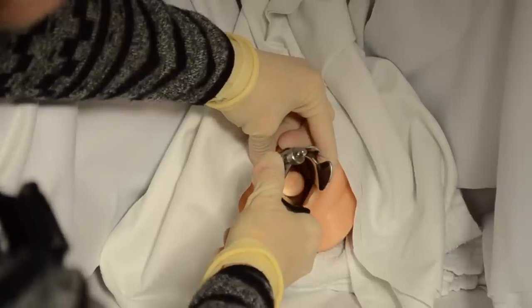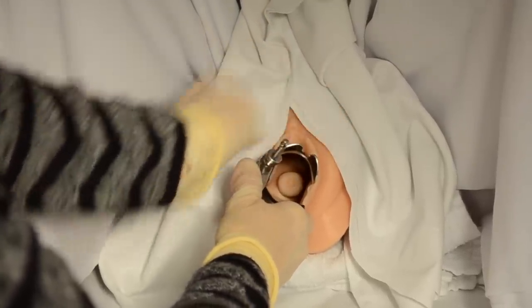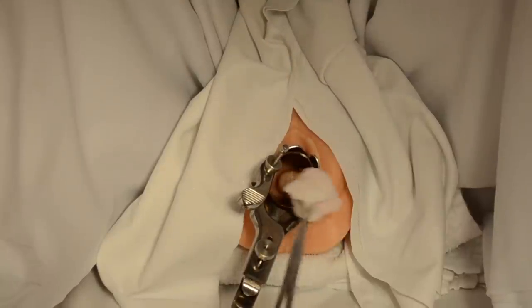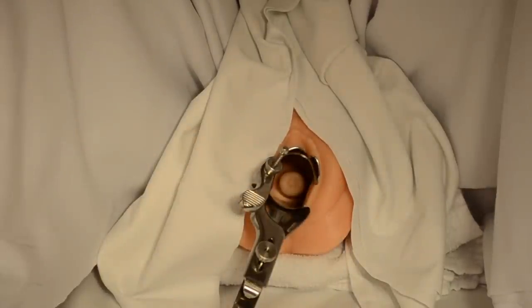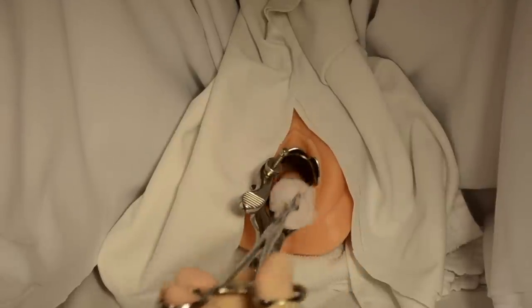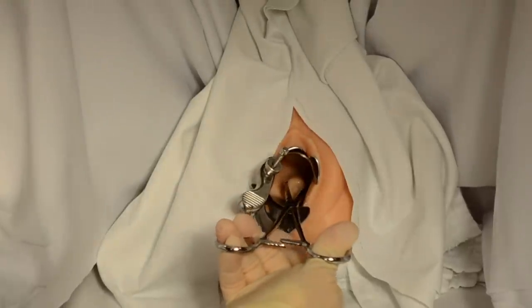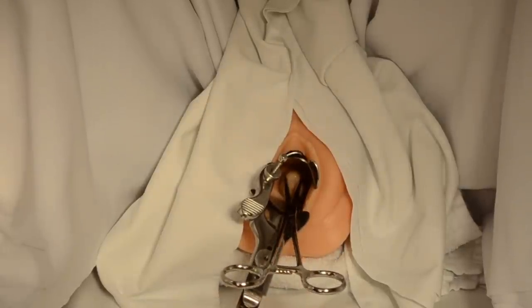This is a sidearm speculum, which I will demonstrate in just a second. Now I can see the cervix really clearly. First I'm going to wash your cervix with some clean solution, and then I'm going to do that one more time, and the walls of the vagina as well. So I'm going to be placing the single-tooth tenaculum on the anterior cervix at the 12 o'clock position. It needs to be placed well enough to be able to pull the uterus and straighten the uterine cavity if need be.